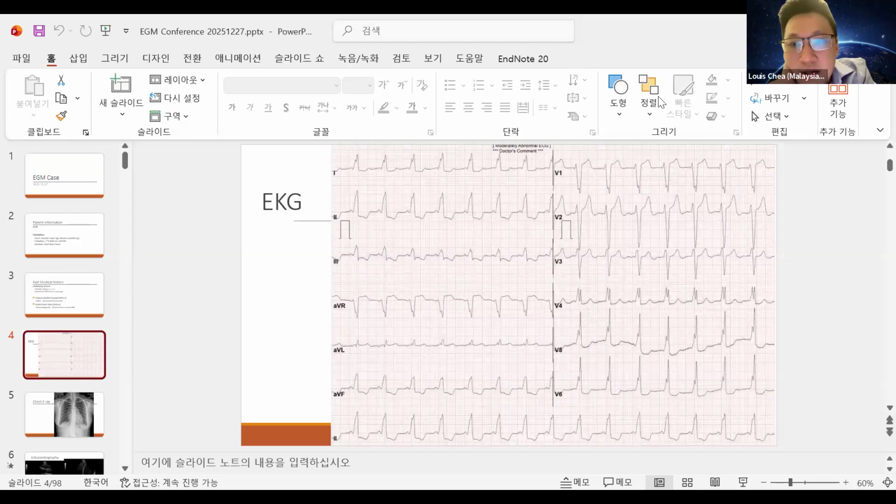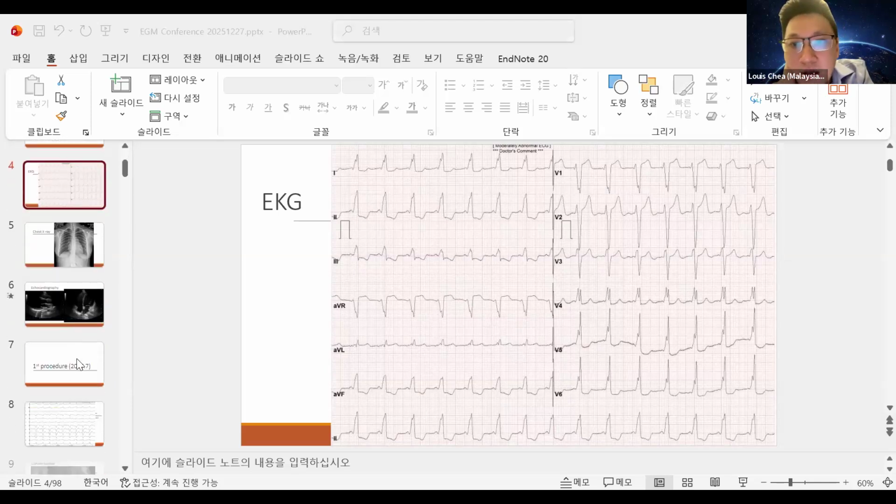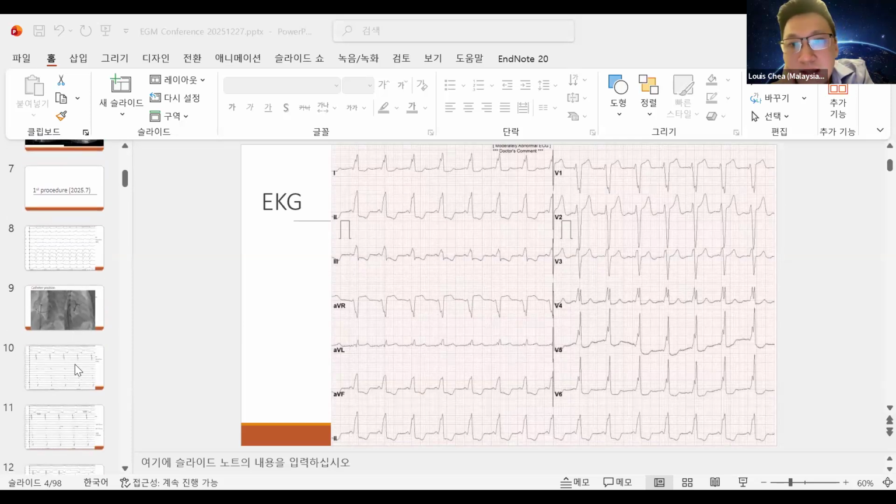I find this ECG interesting, and also the initial ECG during the EGM. I find there are some differences when you were doing atrial pacing compared to this ECG. On this ECG, it seems that there is a bypass track. There is an initial positive R wave in V1. You have mentioned that it's an early transition, which we might think is more subtle.